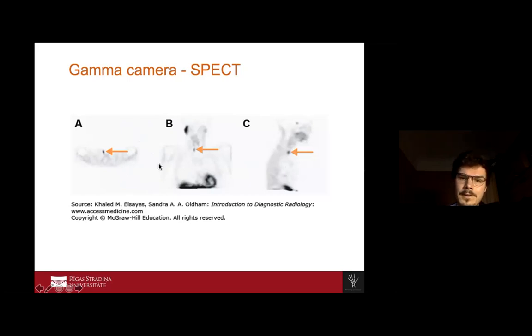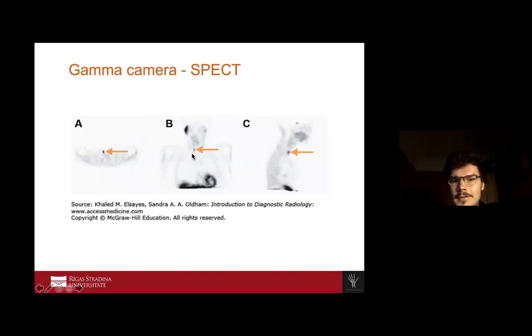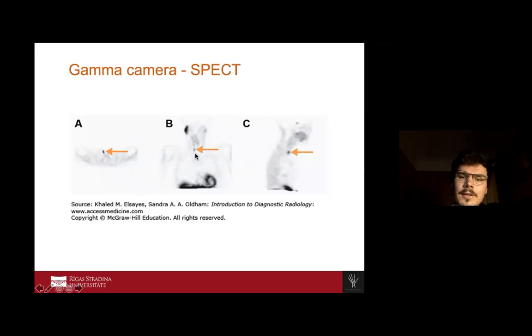In this SPECT image, we can see a black dot on the right thyroid gland, showing there is some activity in the right thyroid gland.